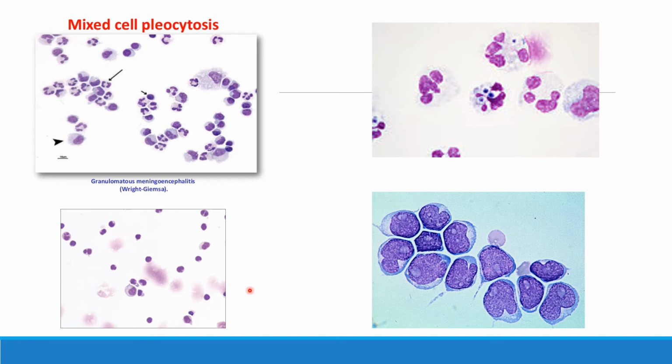In this case here, however, the patient obviously has an increased white count. This is not less than 5 cells per microliter. This is a lot of cells. And you can see that if you look at them closely, they're a little bit small. But there are more lymphocytes in this particular case than there are segs. That would be a sign of viral meningitis, where you see the preference for lymphocytic increase, okay? Whereas with bacterial or, in this case, fungal infections, you see the segs attacking.